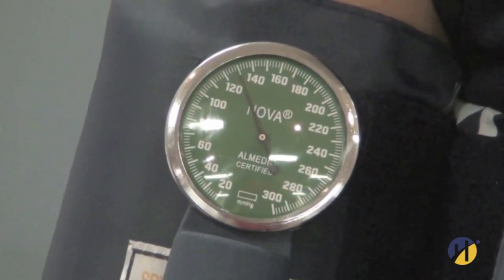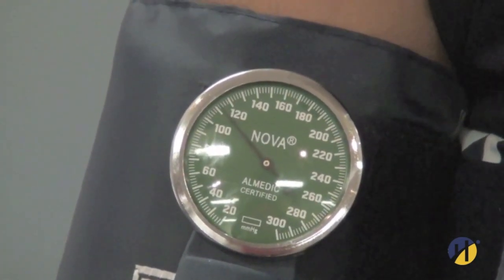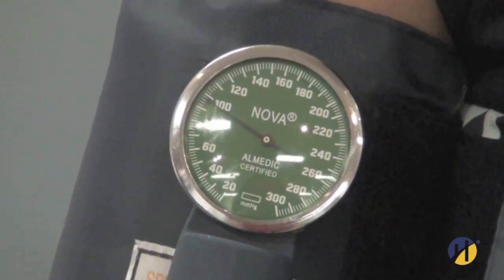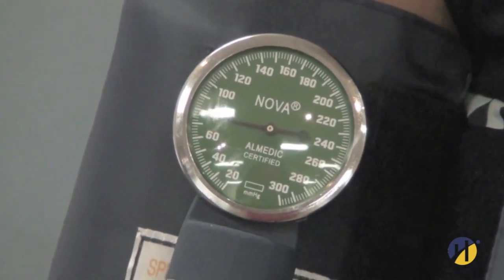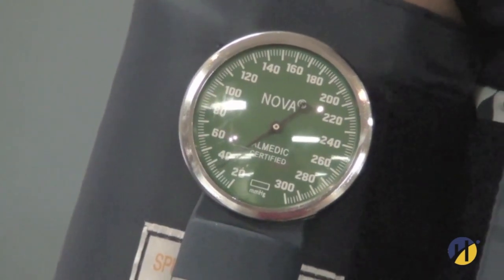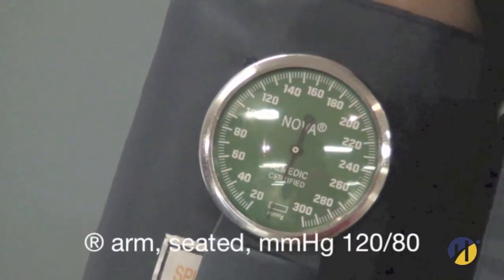The first and last audible sounds are recorded as systolic and diastolic pressure. Repeat the above procedure. Two measurements should be taken in the same arm and in the same position. Record the blood pressure to the closest 2 mmHg, the arm used, and whether the patient was supine, standing, or seated.